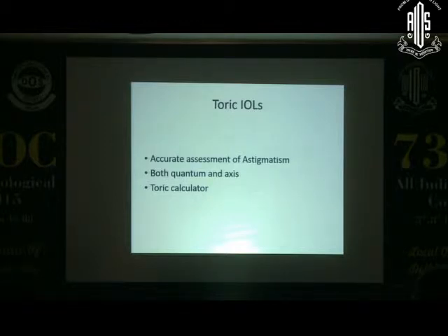You'll get the K2. The difference between K1 and K2 is the astigmatism, and the two axes that you measure are brilliantly accurate, as you would get from a tomographer. So again, you don't have to go for an automated instrument. Of course, automated instruments do make life easier and are very accurate, but you can get brilliantly good results using your normal manual keratometer.